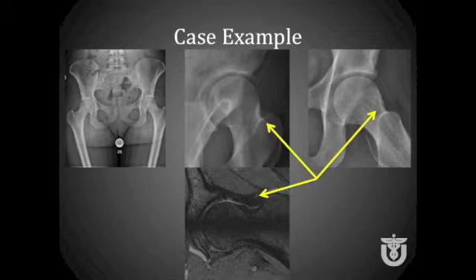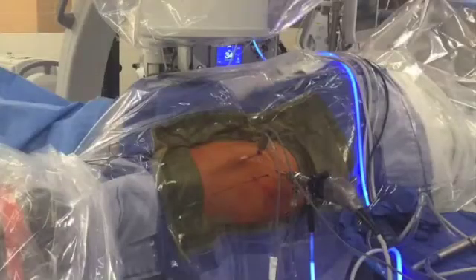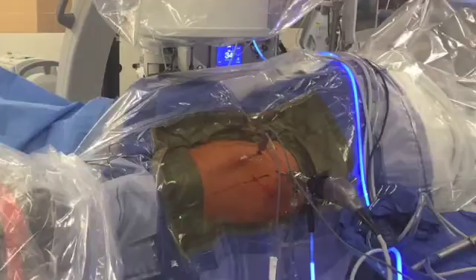The arrows highlight the area of the CAM lesion with a thickened sclerotic cortex and the out-of-round appearance seen on the films. I perform all of the osteochondroplasty through an interportal capsulotomy by visualizing through the anterolateral portal and placing my working instruments through the mid-anterior portal.